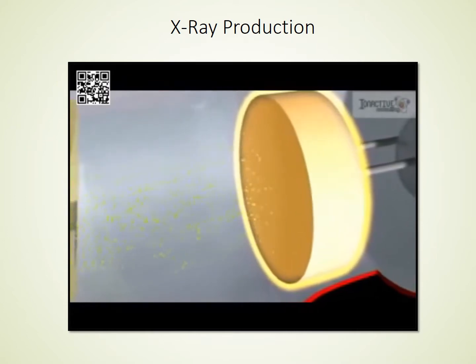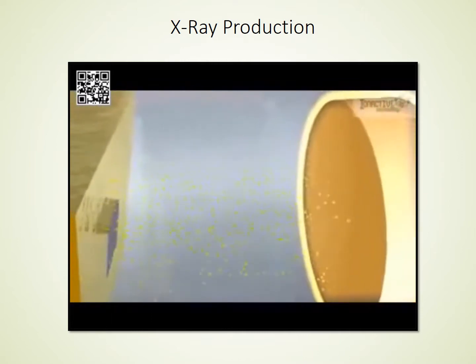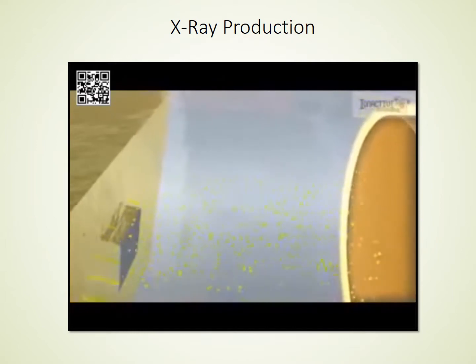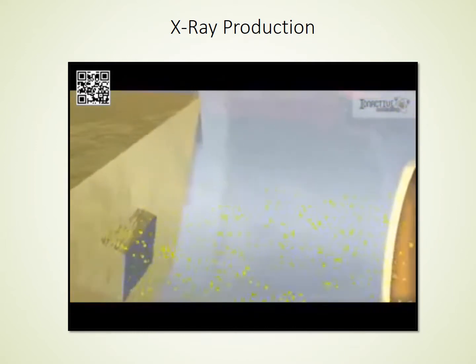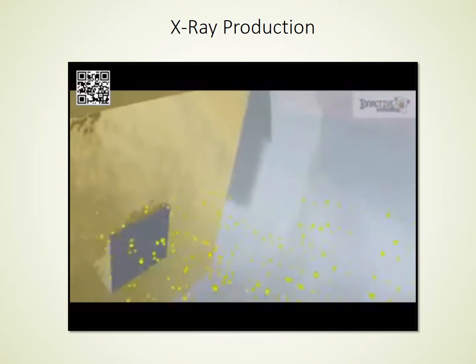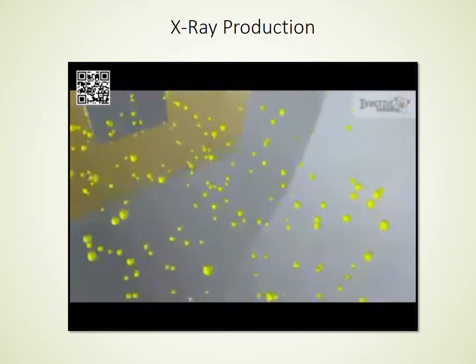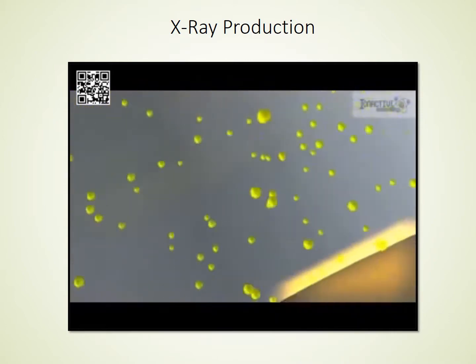the cathode towards the target. The cathode is shaped to focus the electrons onto a small portion of the target, which increases the intensity of the X-rays produced. The target is typically a piece of tungsten or molybdenum, which may be embedded in a stationary water or oil-cooled rod or on a rotating disc.